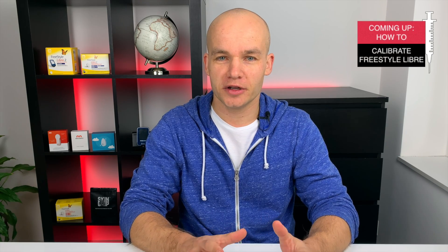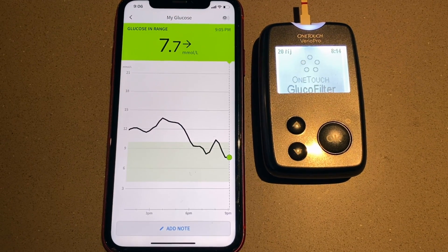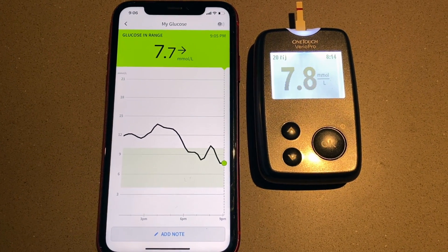I'm back with another Freestyle Libre video. In this one I will show you how exactly I calibrate my Freestyle Libre to get better accuracy of my sensor readings. I will talk about a few things you should consider before you decide to calibrate and I'll share a few tips that will help you calibrate your sensor right the first time and not mess up.